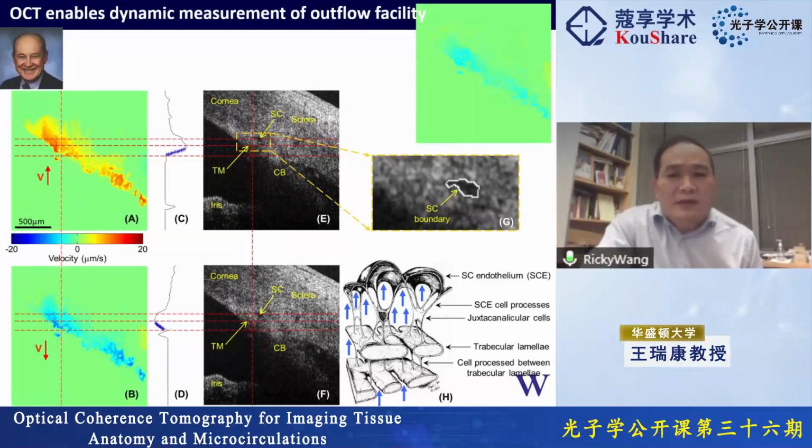Okay, so this is anatomical imaging using the OCT systems, and in the imaging we are looking at living tissue, right? Looking at human living tissue. All living tissue needs nutrition. Where is the nutrition coming from? Nutrition is actually coming from the blood. So one obvious question is whether OCT can be used to look at the blood flow, right?